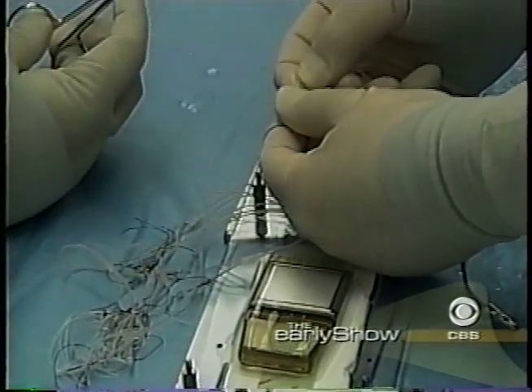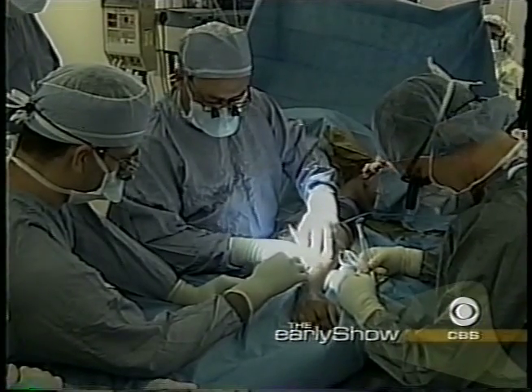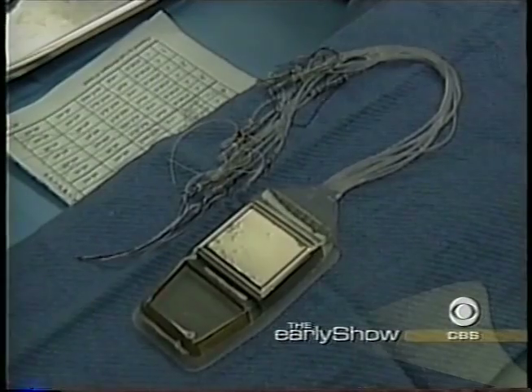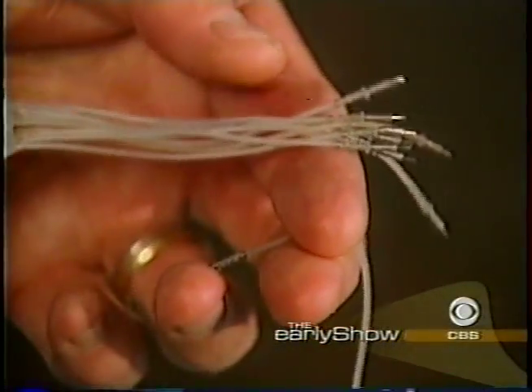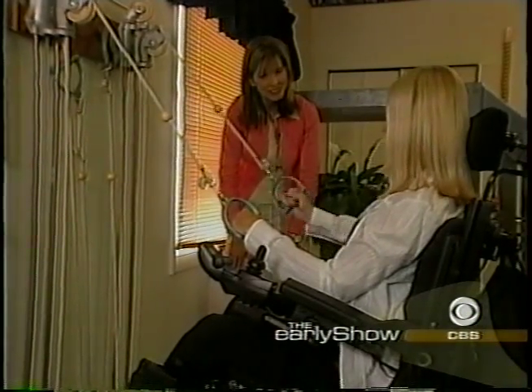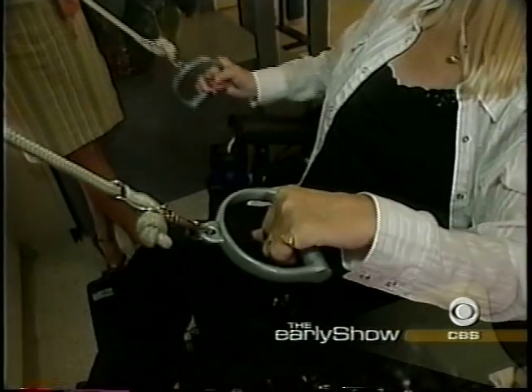These electronic implants are perhaps the nearest close-in way of restoring or correcting major nervous system dysfunctions of the body. Dr. Peckham says research is underway to advance the technology, from developing a computer network to go inside the body to implanting nerve-stimulating electrodes in the brain. The opportunities in the future of this, I think, are enormous. It involves all of the other motor systems that can be restored. The ability to stand, the ability to walk, the ability to control your bladder, are all things that we're working on. And that's good news for Annette, who says now that she's mastering these movements, she's ready to do more.